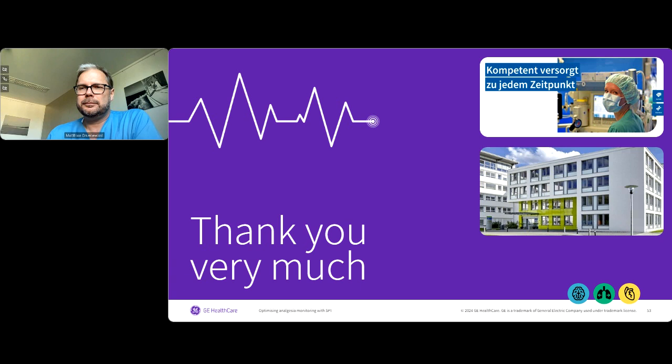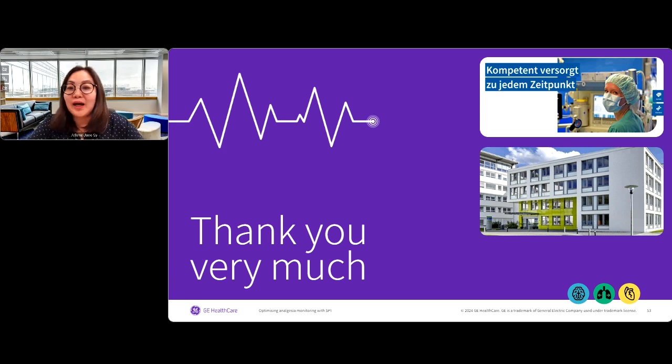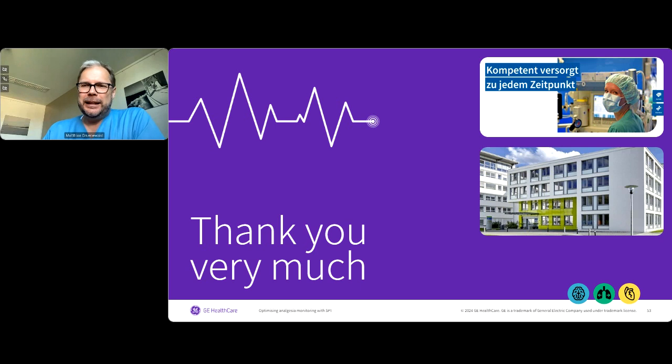The last question for you, Professor Grunewald. Do you think SPI plays a role in the goals of ERAS? I think using less opioids is one main goal in the ERAS concept, and therefore this may really help us be in the correct dosage of anesthetics. As I've shown you in multiple places during my talk, it gives a faster emergence. It has less agitation during the emergence phase. All important points of the ERAS concept. So therefore, it's a clear yes, it is.